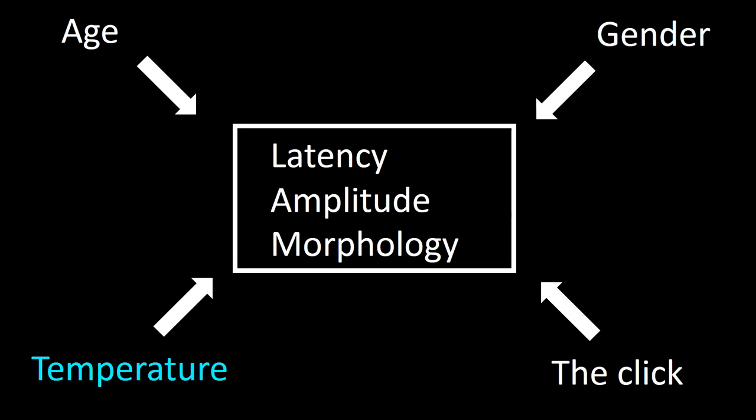Temperature has a significant effect on latency, amplitude, and morphology of the brainstem auditory evoked responses wave. The changes in morphology result from the changes in latency and amplitude.